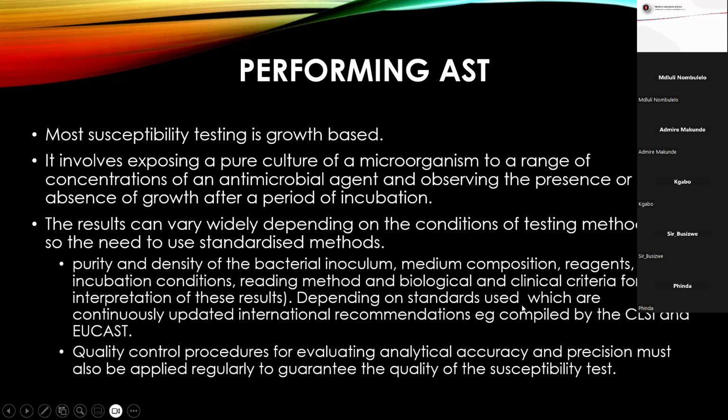The commonly used standards when doing AST are the CLSI guideline and EUCAST. These are updated now and then, almost on a yearly basis, or when there's a major change in the resistance pattern, or if there's new information on AST or resistance patterns within certain organisms.